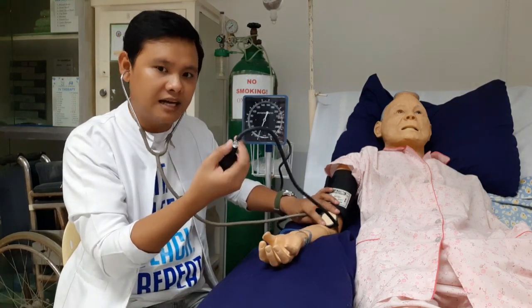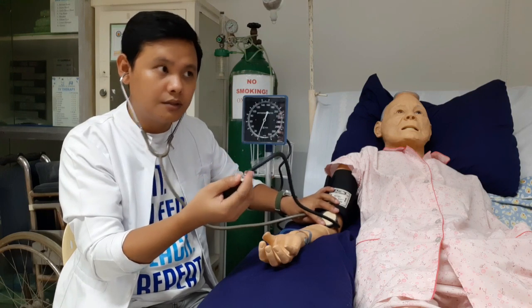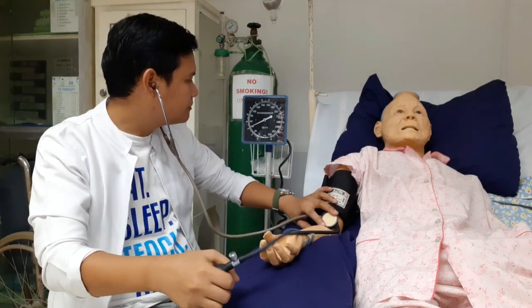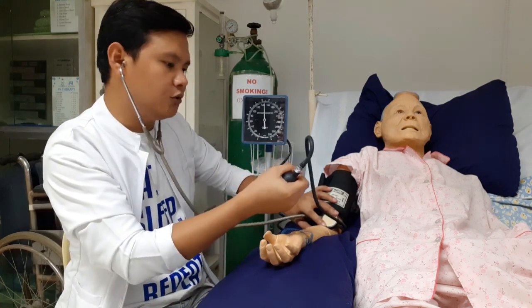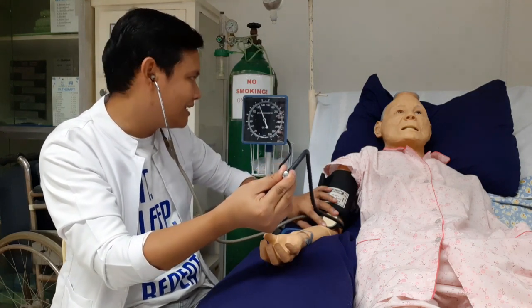Lock the valve. And then, pump hanggang umabot tayo sa may 150. And then, dahan-dahan natin i-open yung valve counterclockwise. Tandaan, dahan-dahan lamang dapat.